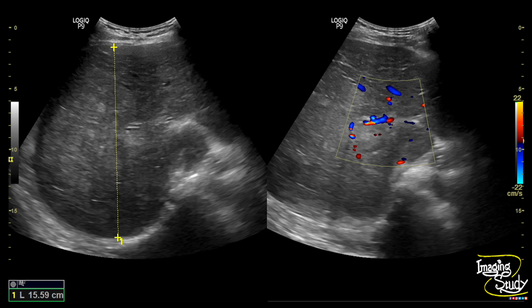The liver was mildly enlarged, and when we apply color Doppler you can see there is a hyperechoic structure occluding the dilated main portal vein, which indicates portal venous thrombosis.